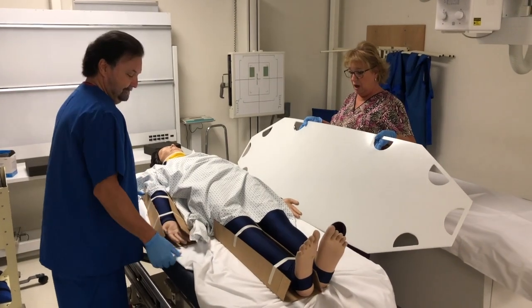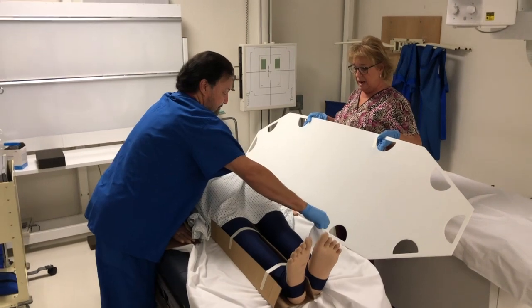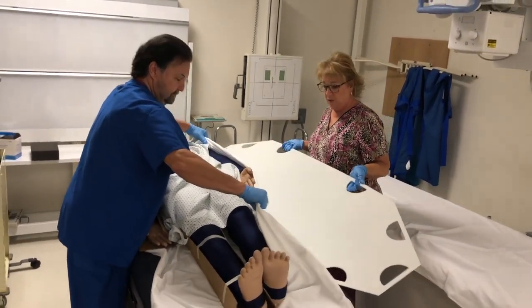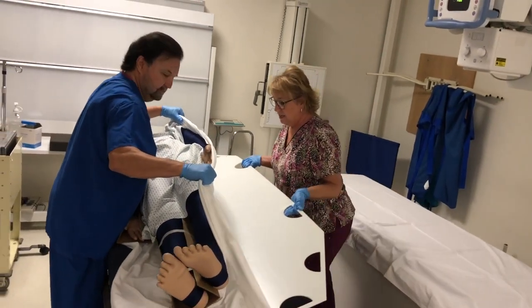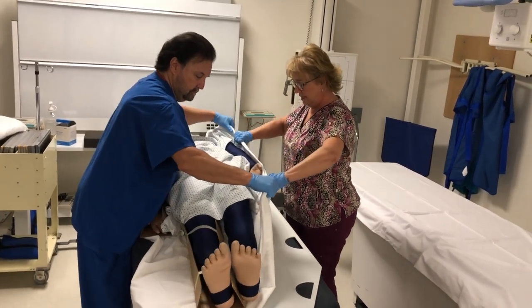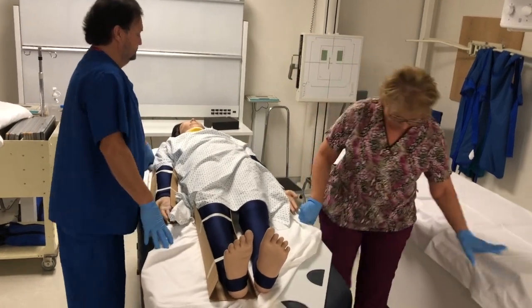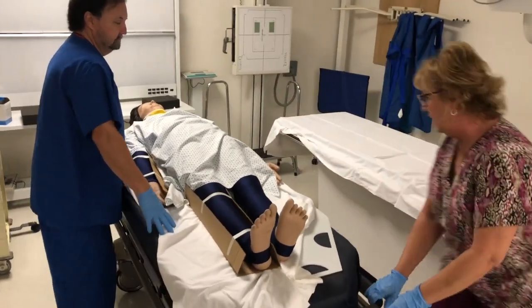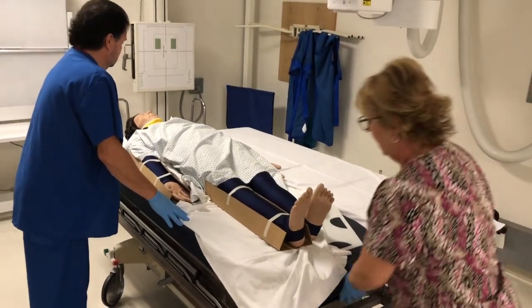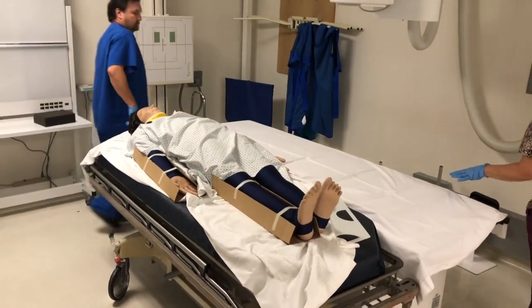Okay, so you would log roll the patient, 2 or 3 people on one side, turning the body as a single unit, and then someone would be on this side, sliding the board halfway under, and then we would roll the patient down. 1, 2, 3. Okay. Then we would get the gurney next to the x-ray table, always keeping in mind that every time you move and position in a different way, you have to lock it.